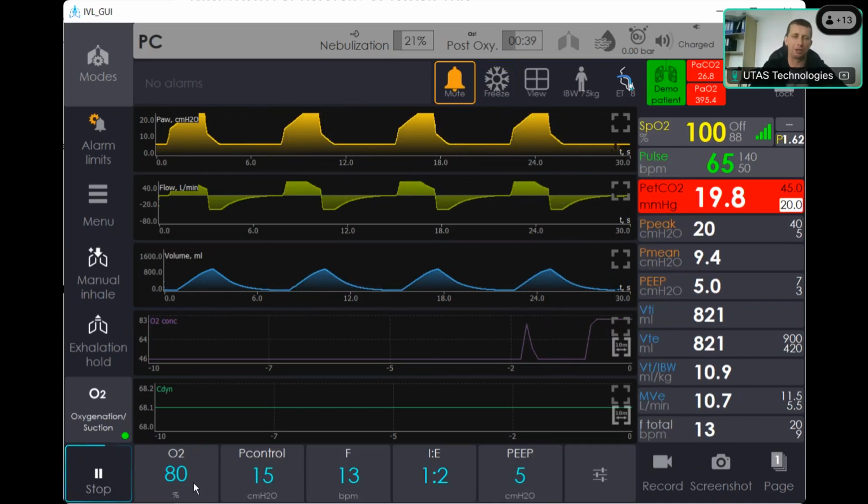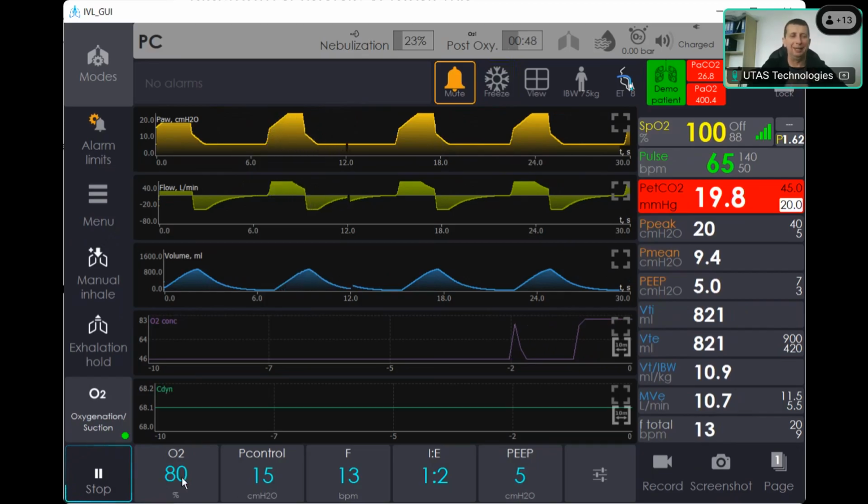and the post-oxygenation stage is applied with an increased oxygen concentration in the breathing mixture in order to saturate the patient again to the necessary oxygen level and reduce potential impact on the brain during the suctioning.